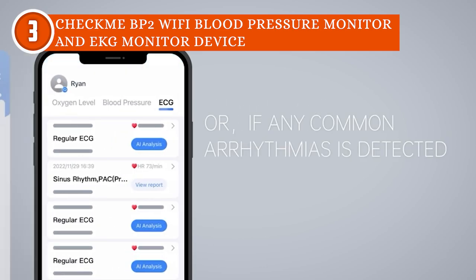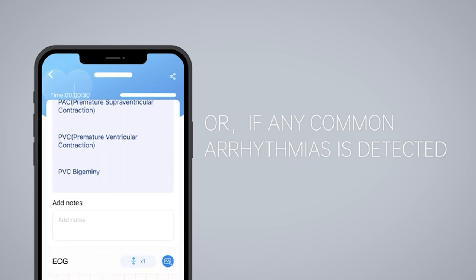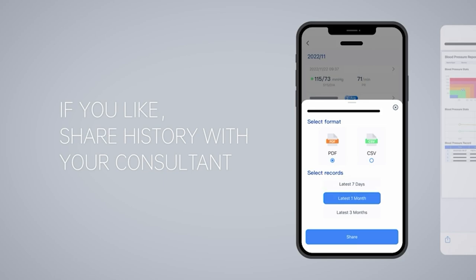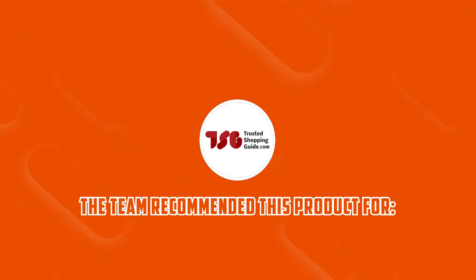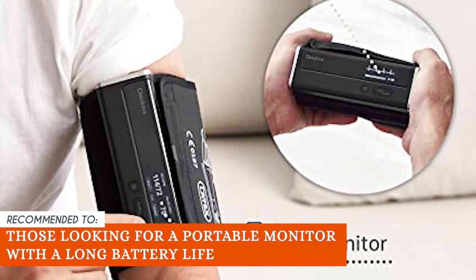While the reading history is accessible from the controller itself, navigating it with the device's two buttons presents some challenges, so we advise using the mobile app in tandem with the controller. The Trusted Shopping Guide team recommends this to those looking for a portable monitor with long battery life.